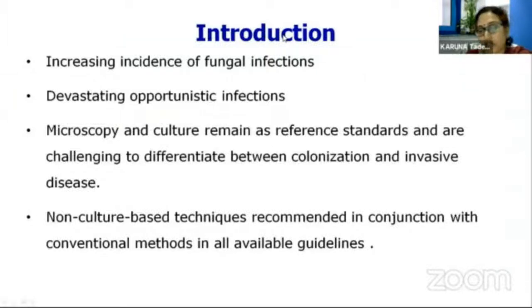But many a time it is very difficult, particularly, as we understood in yesterday's lecture, in invasive fungal infections like aspergillosis, to differentiate between colonization and invasive disease. So there are a lot of recommendations for performing serodiagnostic methods so that our correlation is good, and we know that in this particular case it could be more towards invasive disease rather than purely colonization. We have witnessed the burden of devastating opportunistic infections in our pandemic, and non-culture based techniques have been recommended. Yesterday we saw a lot of recommendations in the molds as well as in the yeasts for the performance of serodiagnostic methods.